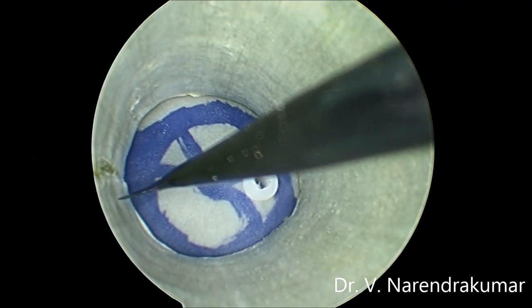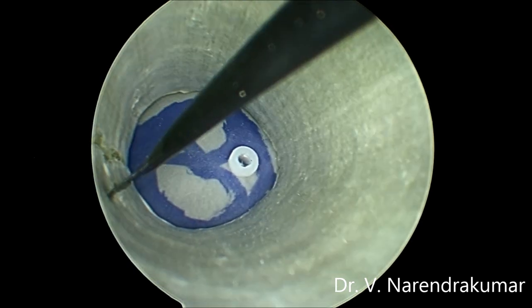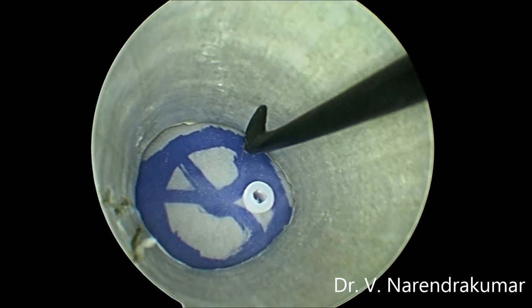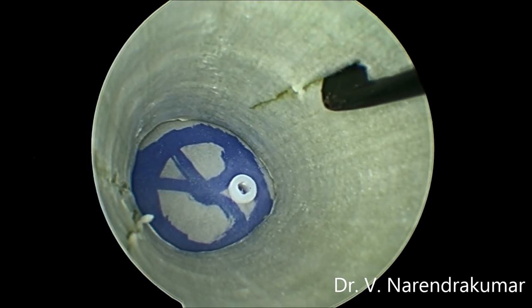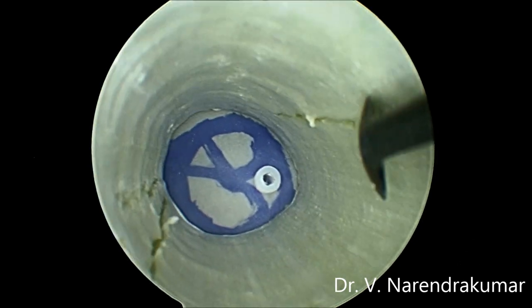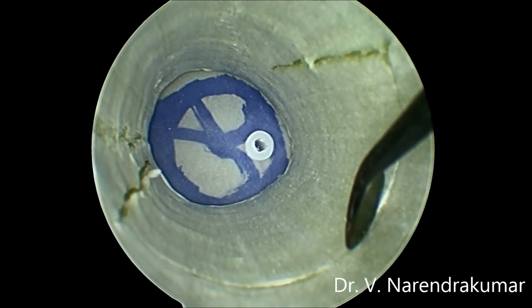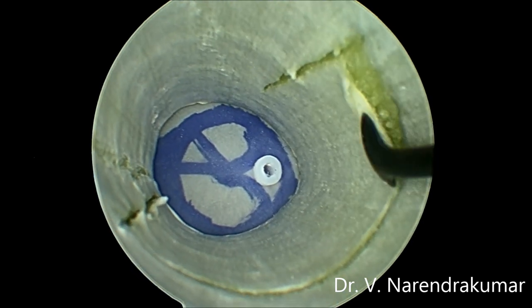The second exercise: here with the plaster knife, I am making the incision over the canal, as we do in the initial step in endoscopic ear surgery. The challenge in endoscopic ear surgery is, of course, elevating the tympanomeatal flap — and we can experience the same feeling here.